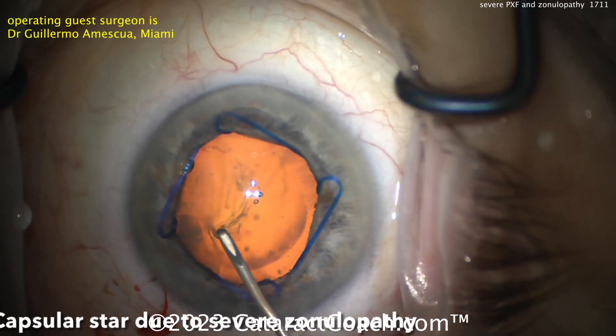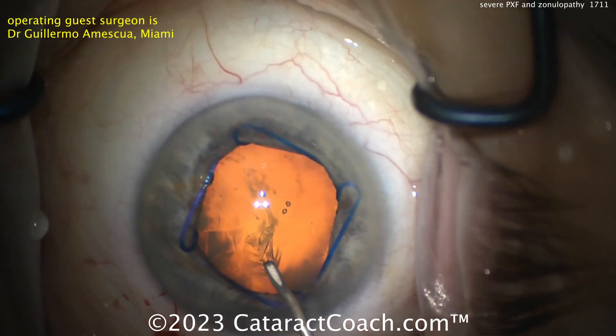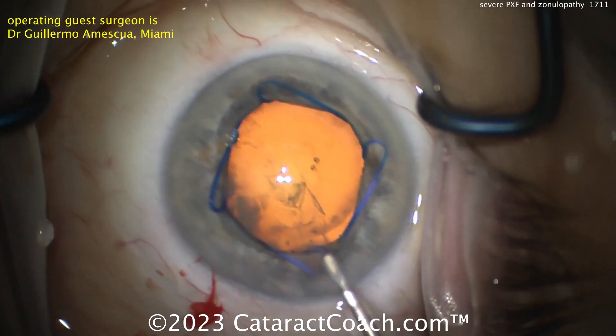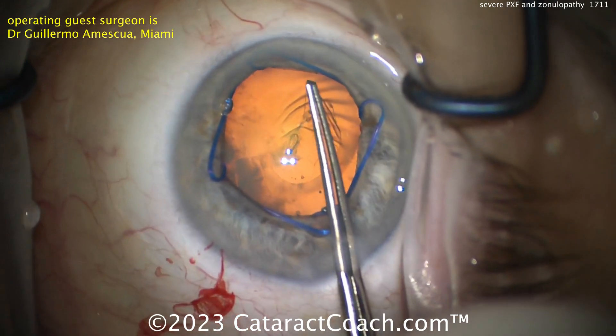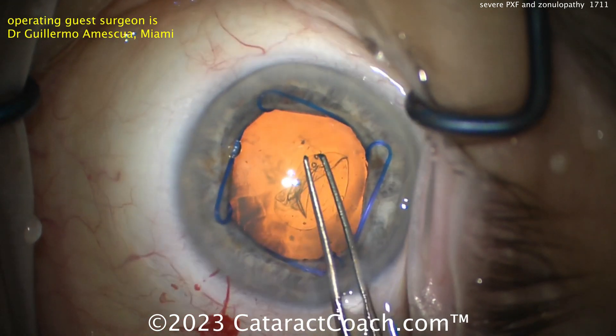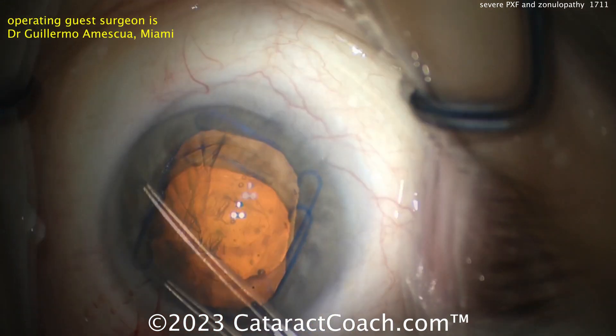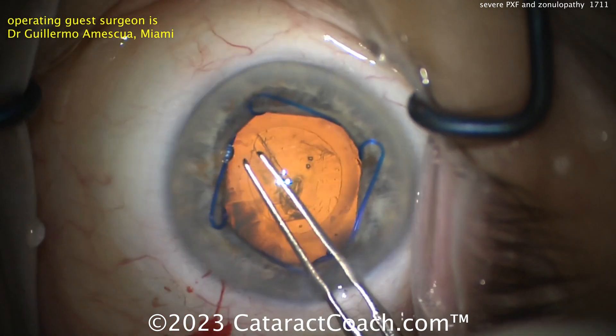Look at all the wrinkles in the lens capsule. You know the zonulopathy is weak because the whole nucleus is moving and you've got a tremendous amount of wrinkling. That wrinkling sign is a warning sign to you. This is global zonular weakness — not just one quadrant, all of them.